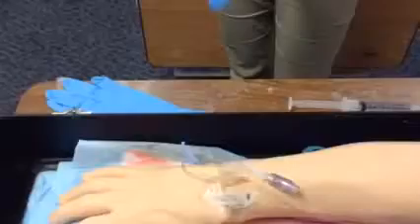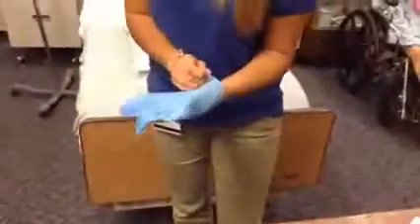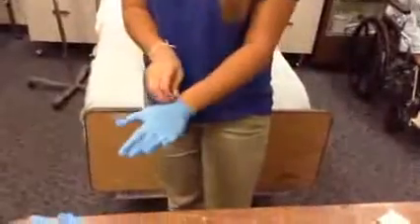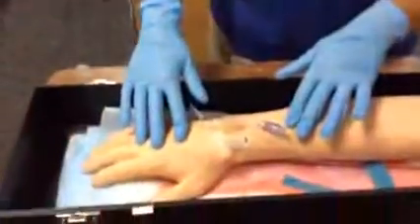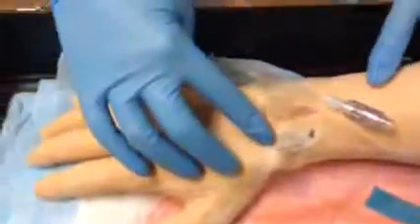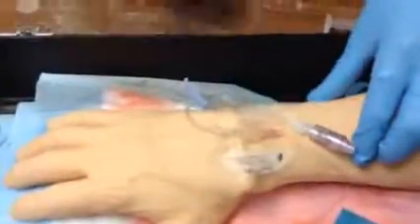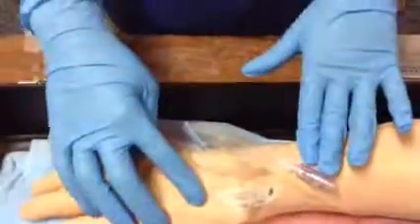Let's go this way. Alright, now we're going to go ahead and assess the IV line for patency. We're going to palpate the IV insertion site for phlebitis, so pain, heat, edema, erythema, or infiltration.